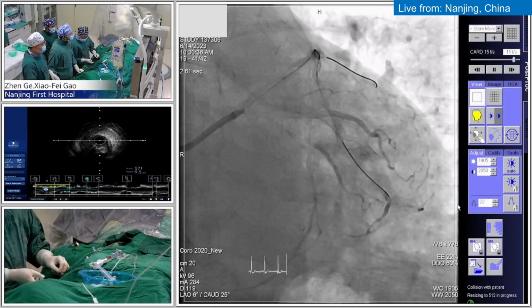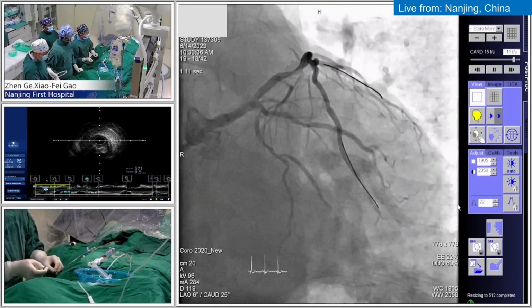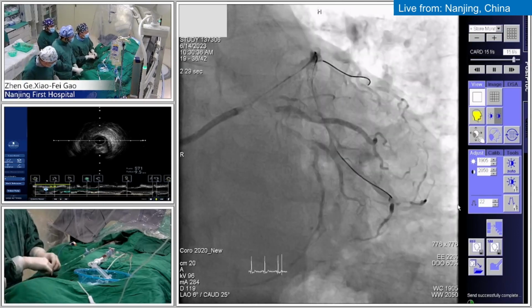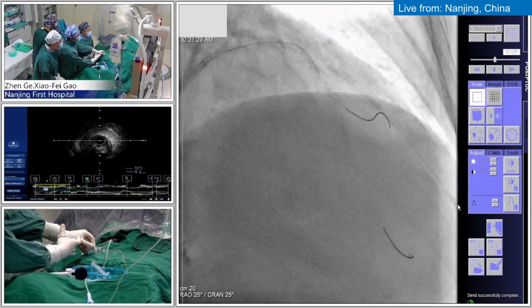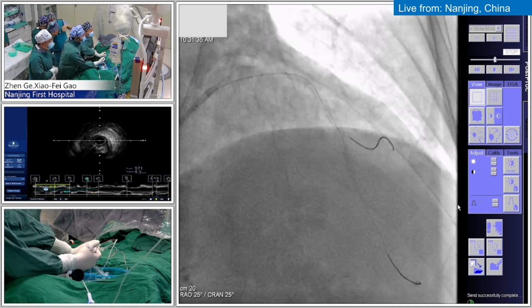The one in the AV groove, of course, there is a tight lesion there at that angulation, but at least the ostium is just fine. The ostium is fine. Its surface is small, and the OM probably is a bigger one. Yes, I will ask them.